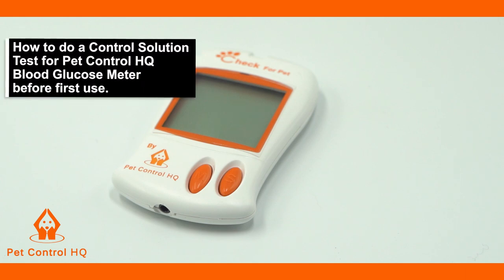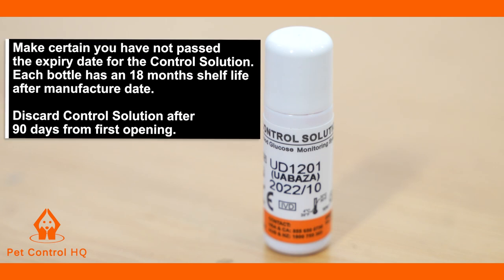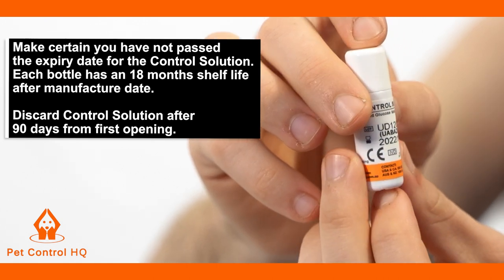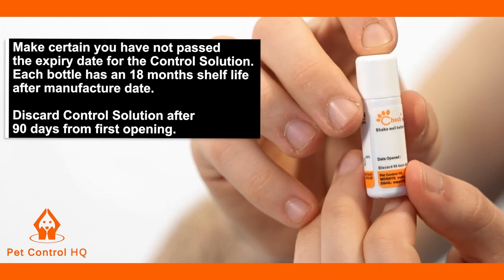This is a brief overview on how to do a control solution test for your PetControl HQ blood glucose meter. Before calibrating, please make certain you have not passed the expiry date for the control solution. Each bottle has an 18-month shelf life after the manufacture date, but once it has been opened it should be discarded after 90 days from the first date it was opened.